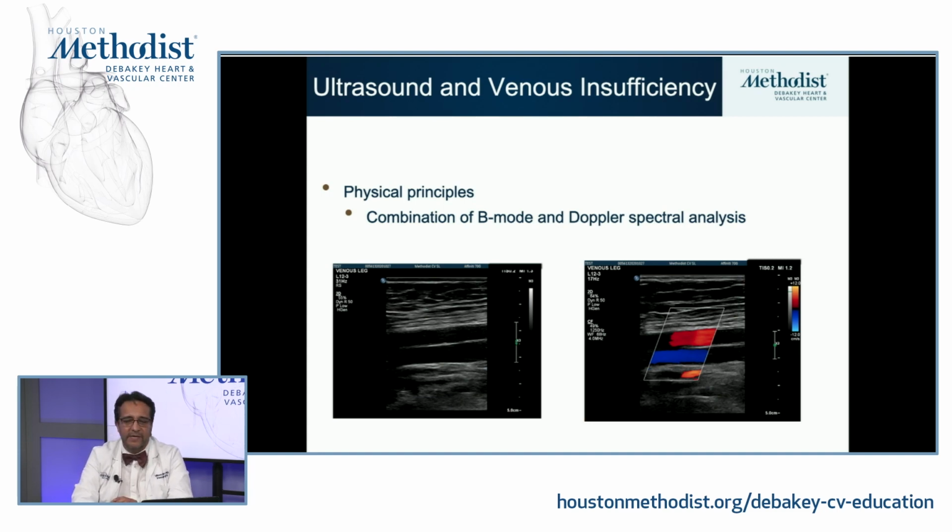Of course, somebody is going to say, well, you can inject tumescent and push the vein down and you get a centimeter. Yeah, absolutely. And what is going to happen to that tumescent? It's going to be reabsorbed. The vein is going to go back to its place, and then you are going to have a nice, beautiful hemosiderin strip along the inside of the leg that the patients love so much. So no, we need to be careful, and I'm a heavy proponent of that. The doctor needs to do a quick scan before proceeding with whatever surgery he or she is going to do.